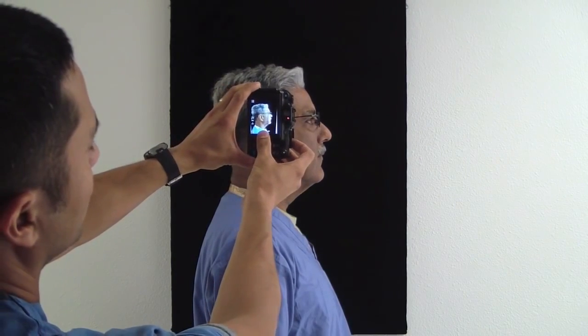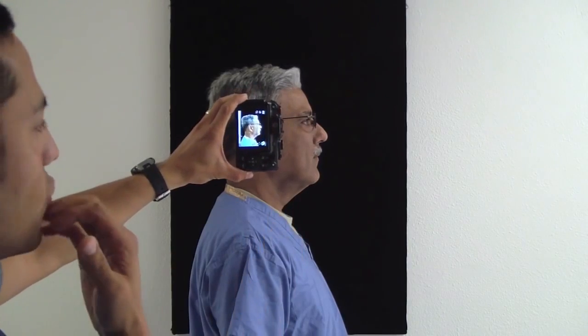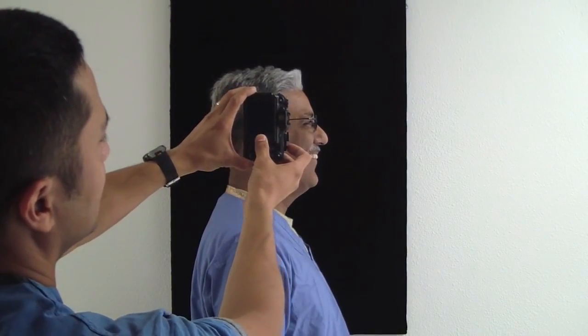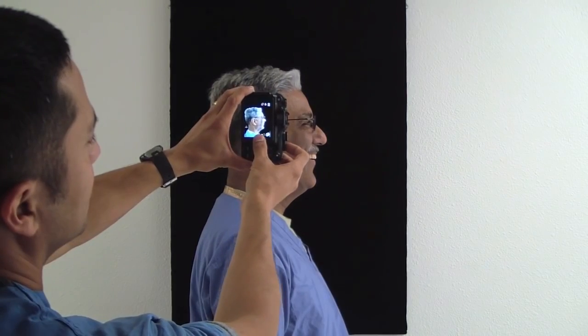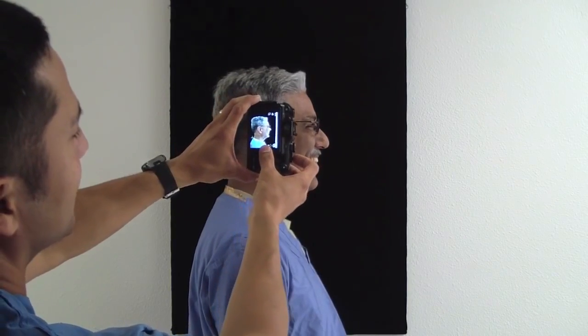And one of our orthodontic mentors suggested that one of the best photos he has in a profile is when the patient's smiling. Just give me a big smile. You just laugh on your own, I love it. Okay, that's good. So we can also do a number of other photos, but these are our basic photos that we'll use in front of our black background.